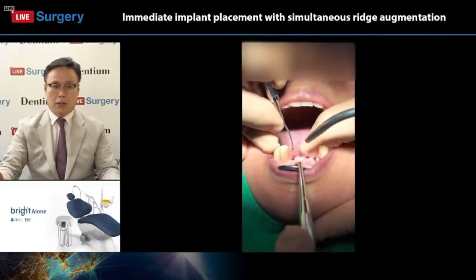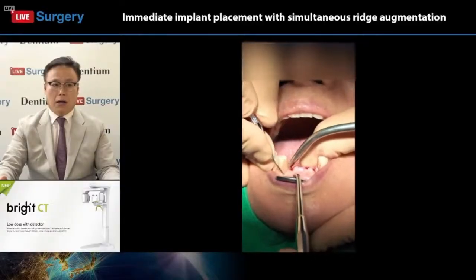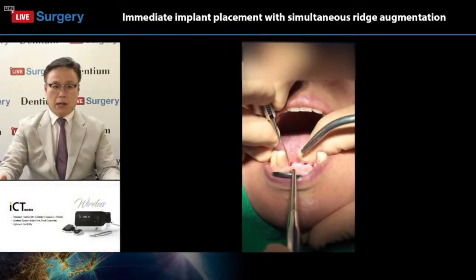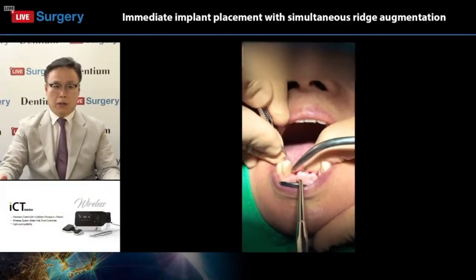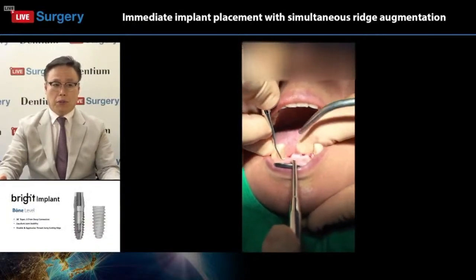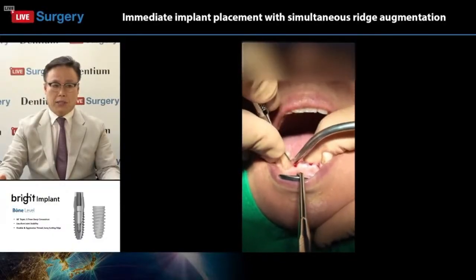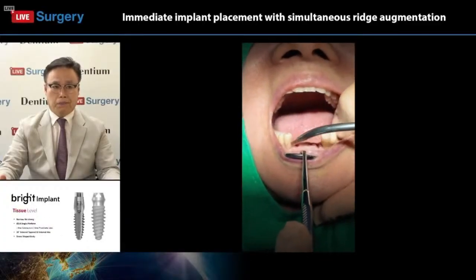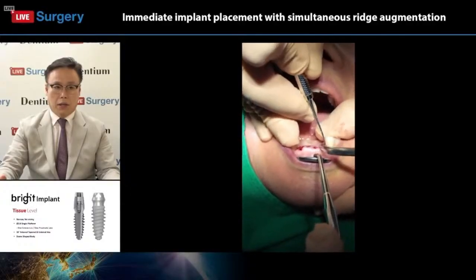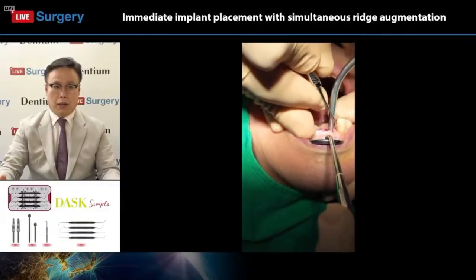So it's important. And another thing is that the root surfaces of adjacent teeth could be a reservoir of biofilm. So for the root planing, I always spend maybe around 5 to 10 minutes to remove the biofilm and calculus from the root surface of the adjacent incisor like this. I apply the Gracey curette on the other side, removing plaque and calculus and root planing.